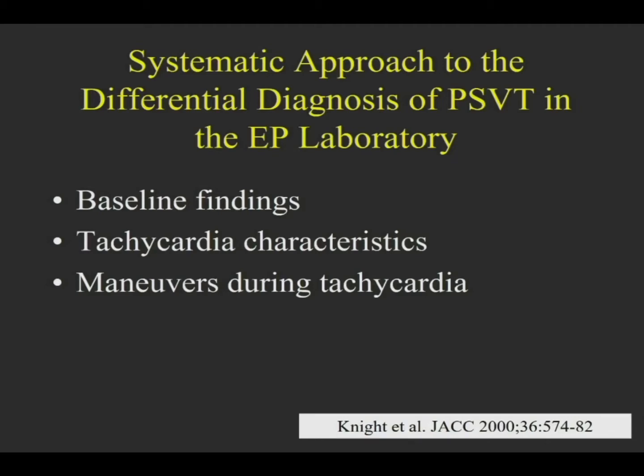So what are the clues that they have an accessory pathway? Pre-excitation is an obvious one, but a lot of these patients, their pathways are concealed. They only conduct retrograde. And so what are the clues that they have retrograde conduction up an accessory pathway at baseline? Now think about what you would be looking for. You would look for abnormal activation retrograde with ventricular pacing, whether there's eccentric atrial activation, whether there's extranodal response to Hisian pacing, and we'll go through all these things.